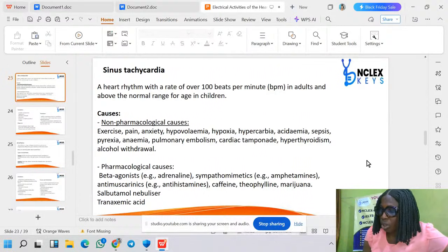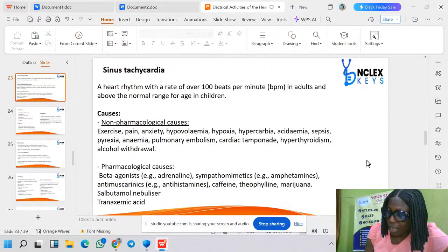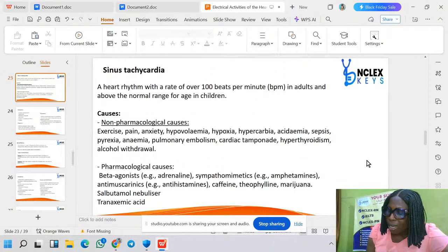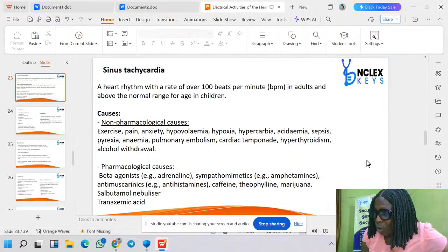You now have options like sinus tachycardia, bradycardia, normal sinus reading, supraventricular tachycardia. At that level, please go back and look at the age of the child. For a 1 year old, that will be a normal sinus reading because their normal pulse is not 60 to 100. I hope you are getting the difference now.